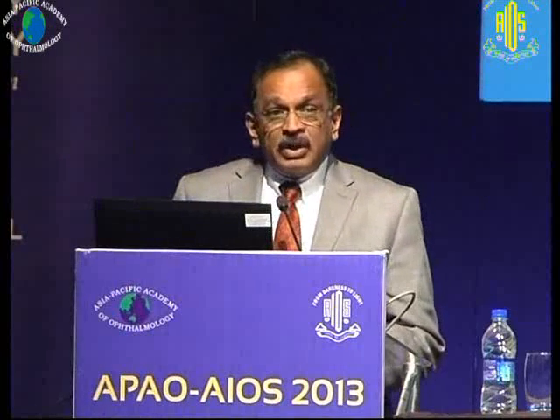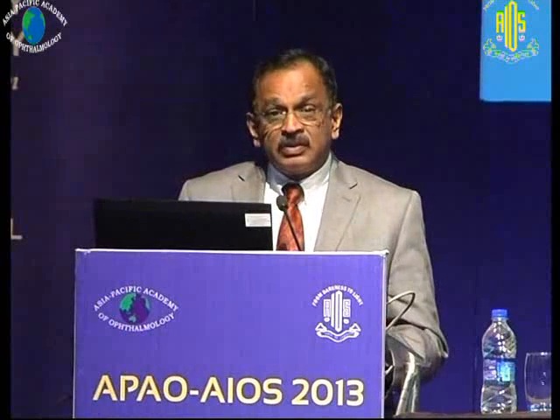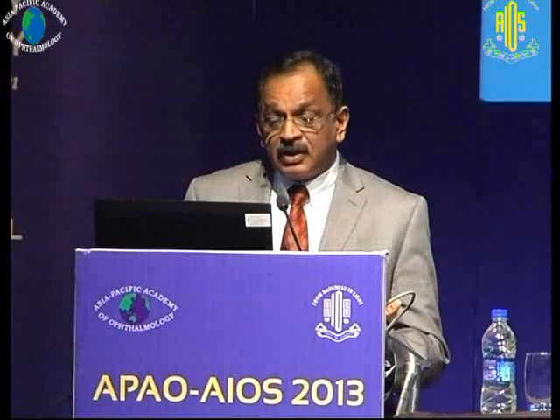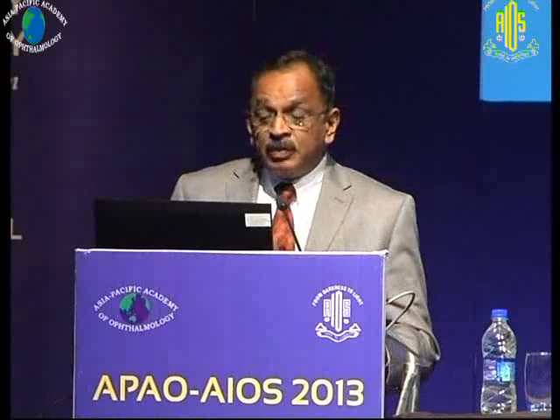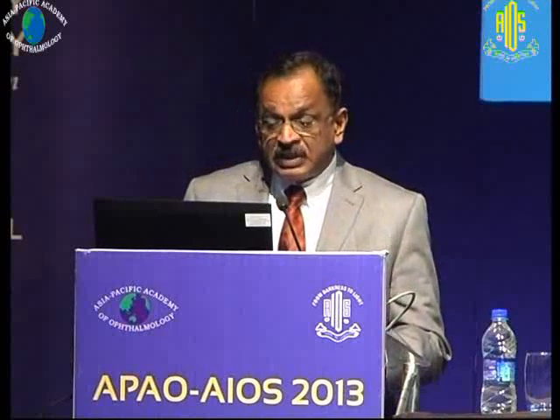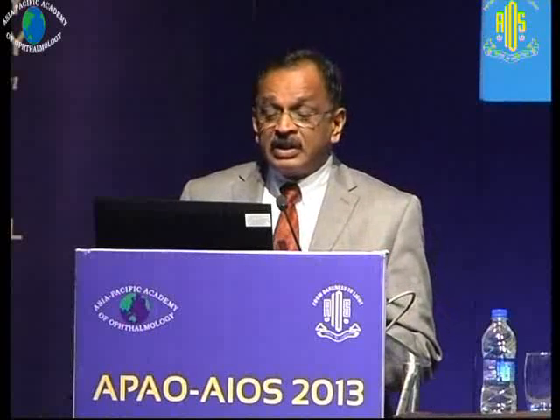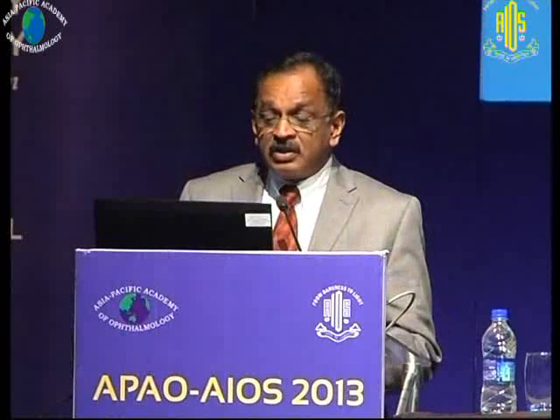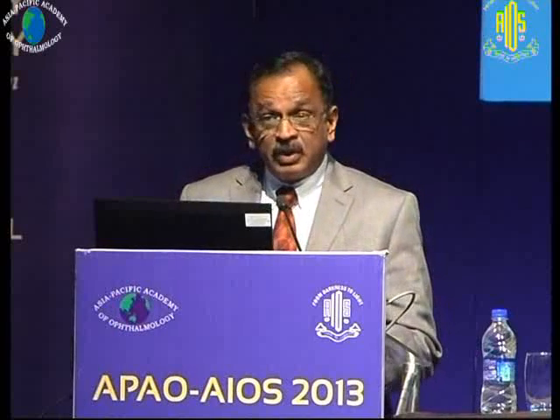Now, what are the common indications for doing retinotomies? Either it's a relaxing retinotomy or retinectomy, which you do in cases of anterior PVR with severe intraretinal fibrosis to stabilize a retinal break with edges being under traction, or a retinal incarceration into a sclerotomy or a scleral wound.